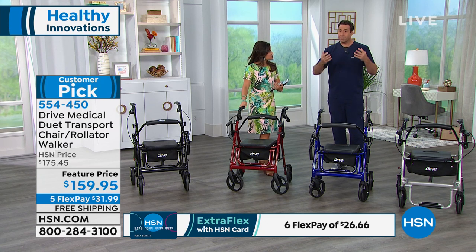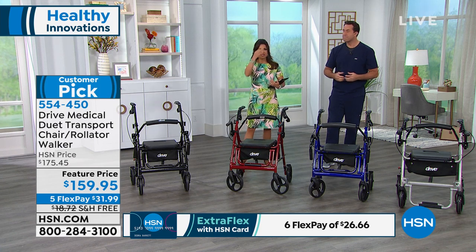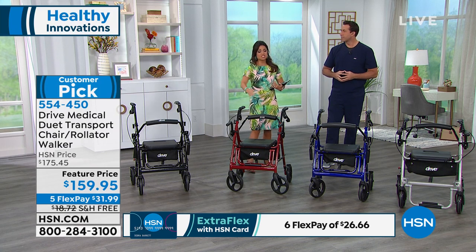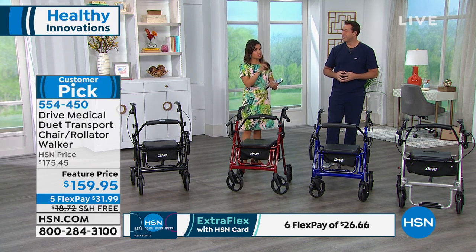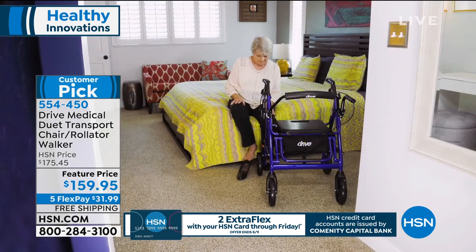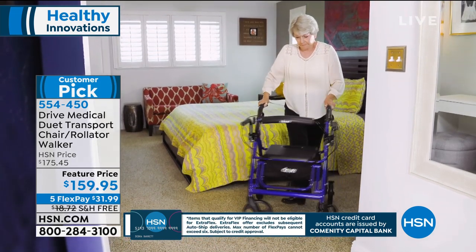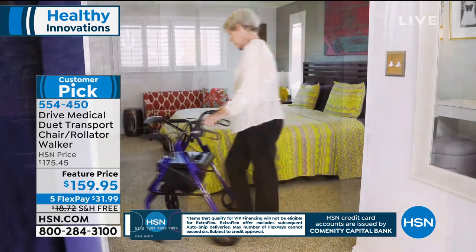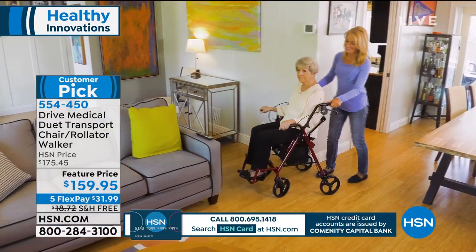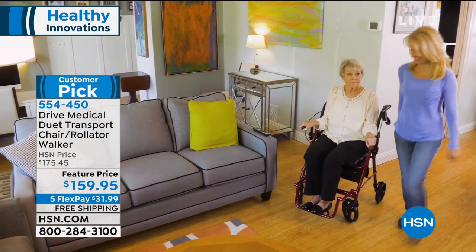20 pounds is all your Duet weighs — easy to transport and easy to store, but it supports up to 300 pounds. It turns on a dime and glides no matter the size of the user. The quality is outstanding — I love that there's a lifetime warranty on this, it says so much about the company. You can do tight turns into tight corners, navigate narrow doorways, and glide on hardwood or carpet because of the high-quality wheels.